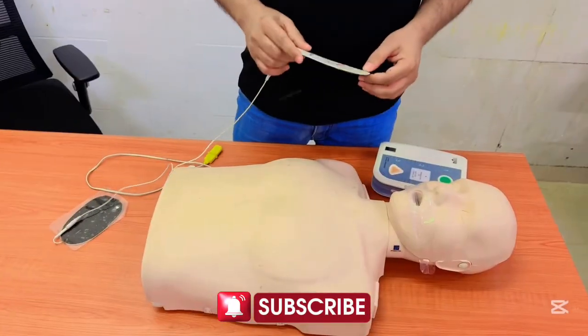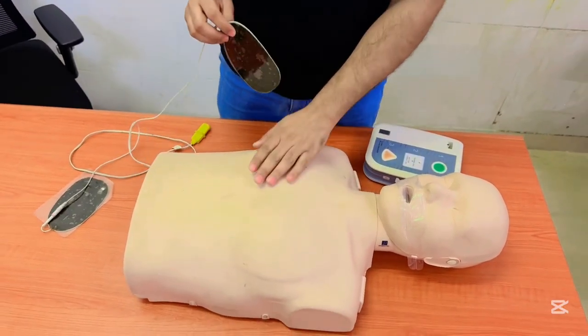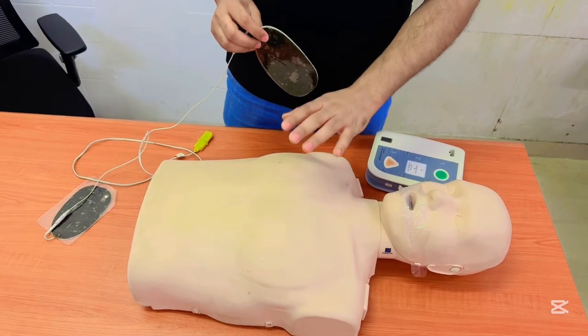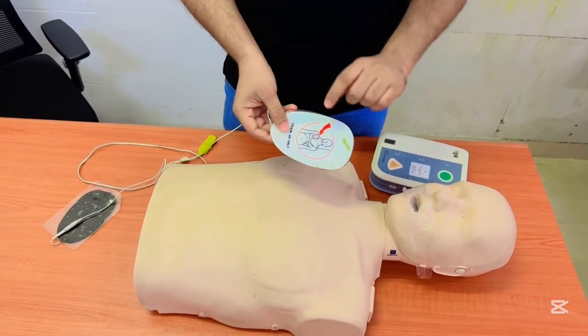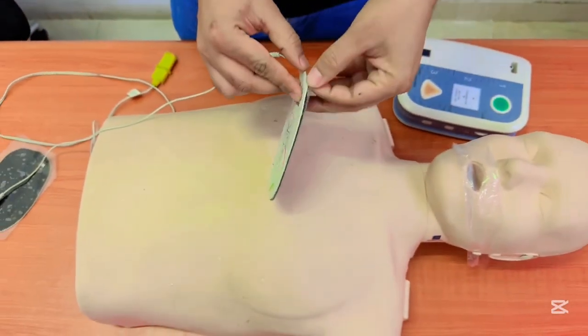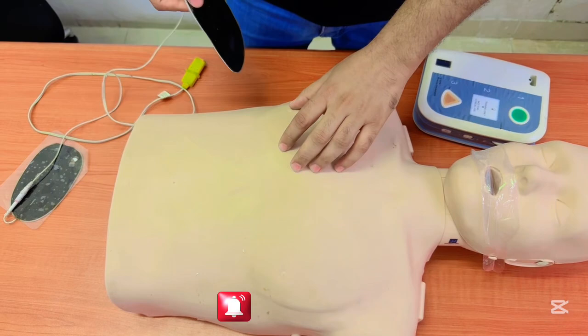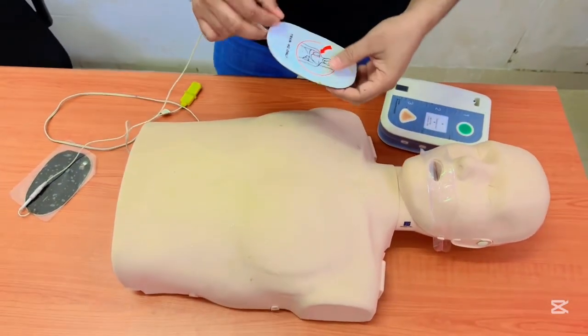For an AED device, we have two pads. First of all, you have to place the pads in the correct locations. The right pad you have to put on the bare chest. If you don't have a shaving kit in your first aid kit, then you have to place the same strip on the chest and remove it with pressure so the hair can be removed. You have to ensure that the pad is properly in contact with the body.